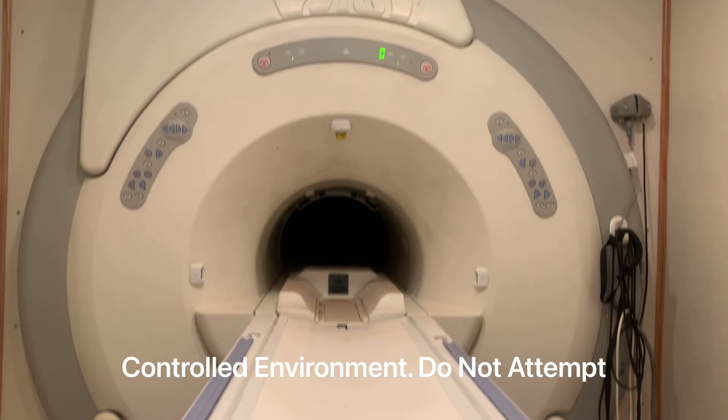Aside from the obvious safety hazards presented with bringing objects into the scan room, your camera may suffer long-term damage such as reduced battery life, inability to focus when taking pictures, or complete loss of function. And this is why it's never recommended to bring any ferrous objects into the MRI scan room.